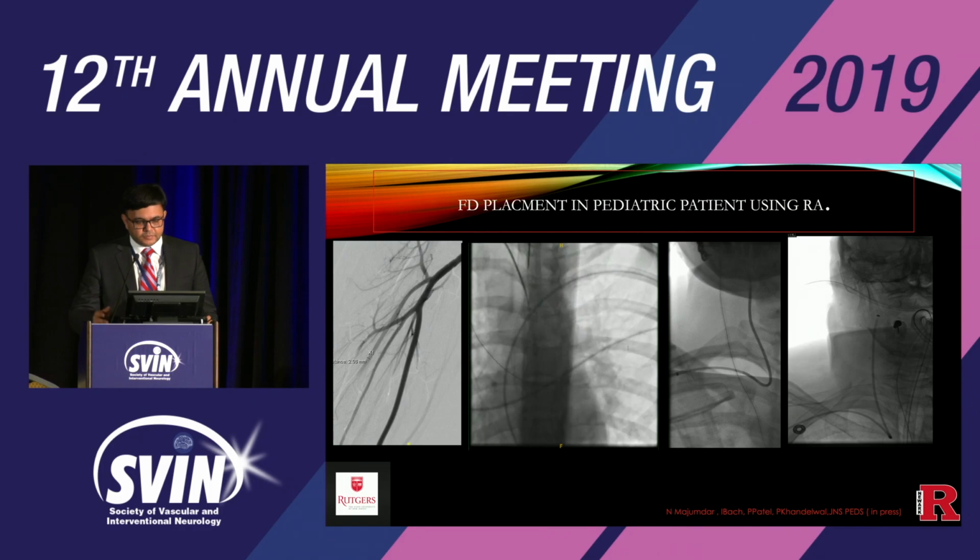And here you can see we are forming the SIM over the aortic valve, but I made a mistake here. I pulled the wire a little bit too early, and you can see the catheter kind of started to herniate into the heart. So I realized it. I pushed the wire more.